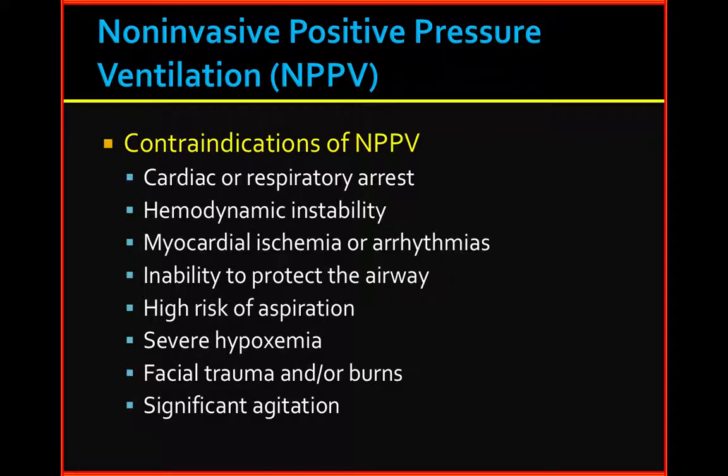Ventilator settings are changed based upon a patient's respiratory compliance and gas exchange. Respiratory compliance, or the lung's ability to stretch or expand, is assessed by measurements of peak and plateau airway pressures from the ventilator. Settings are based upon our patient's needs. That leaves us with 4 potential variables to adjust: tidal volume, respiratory rate, FiO2, and PEEP.